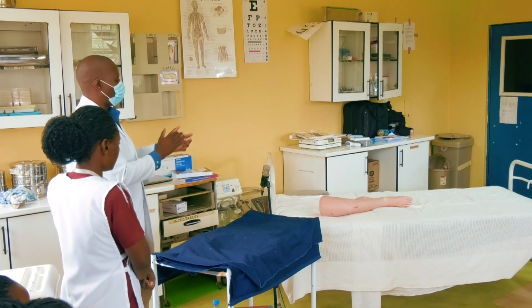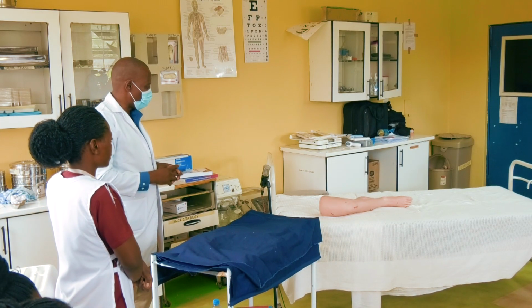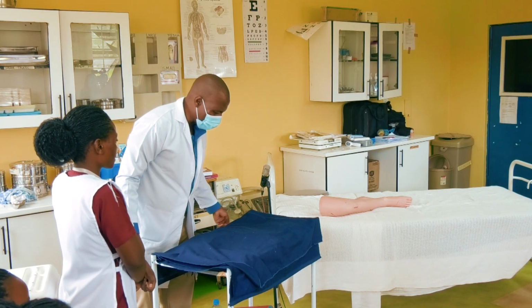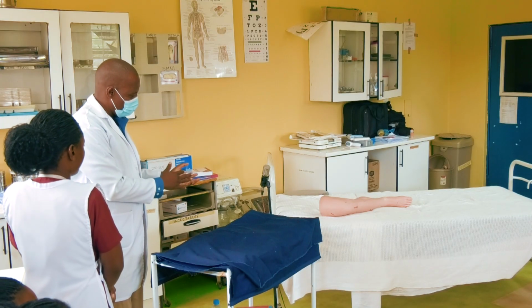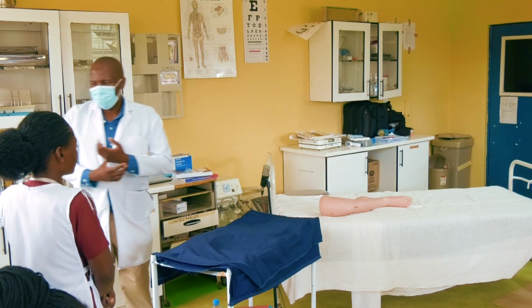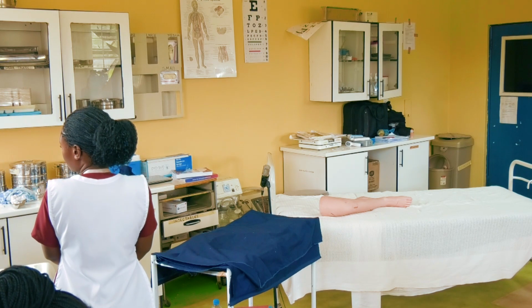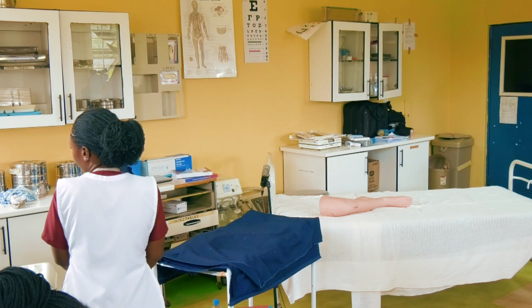So we've gotten permission from the patient. We've talked to the patient about the need for us to go and clean the wound. I don't know if where we are going to stand is fine. So even when you are wheeling the trolley to the patient, we've gotten permission, we've come back. Remember, after talking to the patient, I'll come back, wash my hands, right? Wash my hands, not surgically.